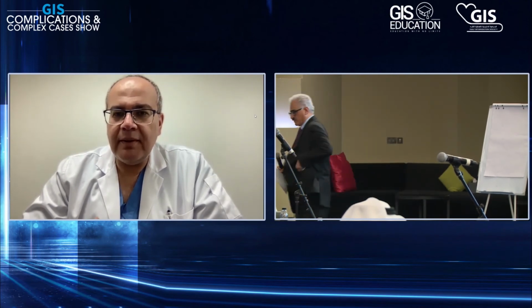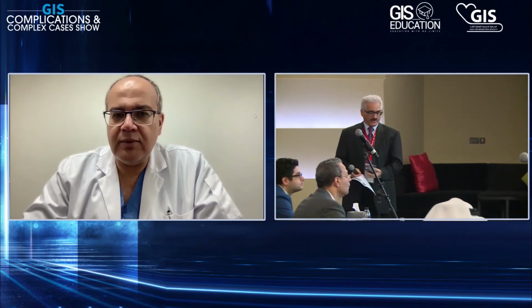But the issue here, what was the threat that we were afraid of? Were we worried about stent thrombosis or about embolization? I think we were worried more about embolization, because the stent was well expanded in a part where there was no specific large plaque burden. So the risk of stent thrombosis to me was not there, for two reasons. Number one, because of the high flow of the aorta. Number two, because the stent, as Dr. Musa said, reaches easily 5 or 6 millimeters, and you saw that it was well expanded into the left main. So the hazard of stent thrombosis was not there.